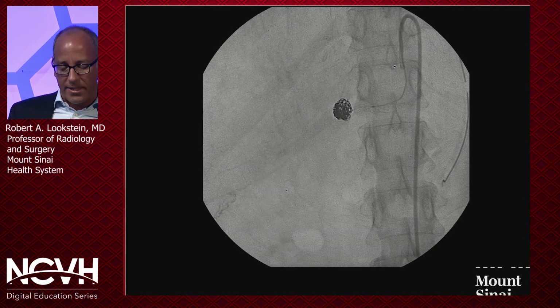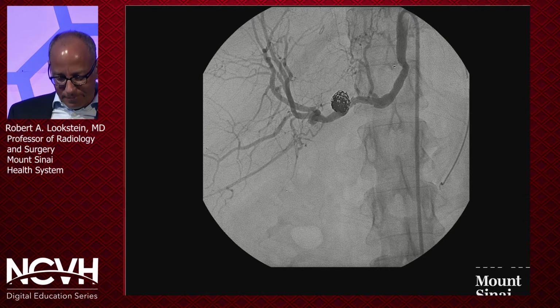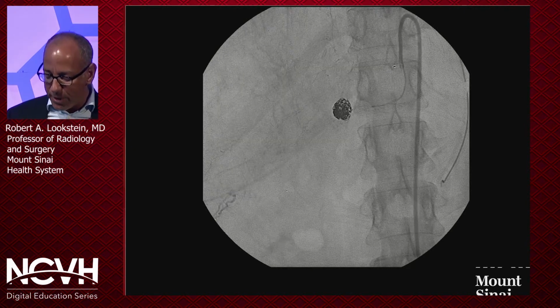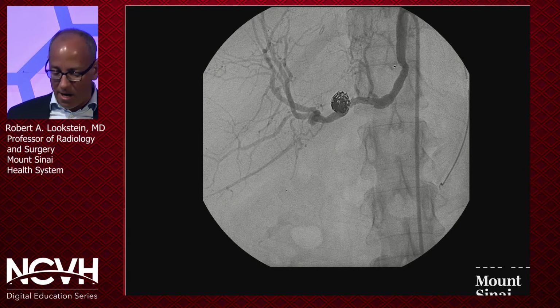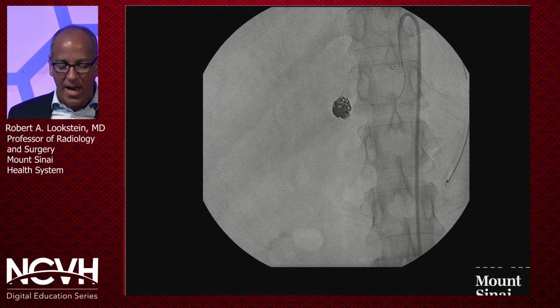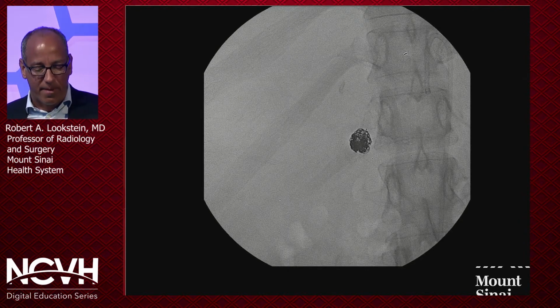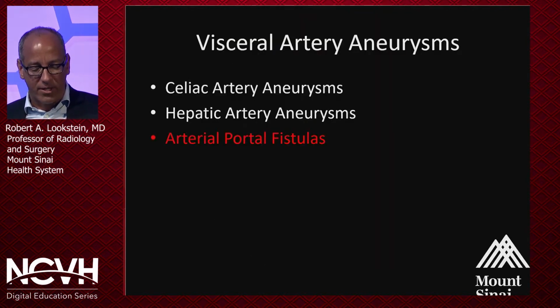here with detachable coils, and a very, very nice result. And again, the perfusion to this organ transplant was actually preserved, and the patient did very, very well with no issues of bleeding or aneurysm expansion afterwards, and just the final angiogram there.